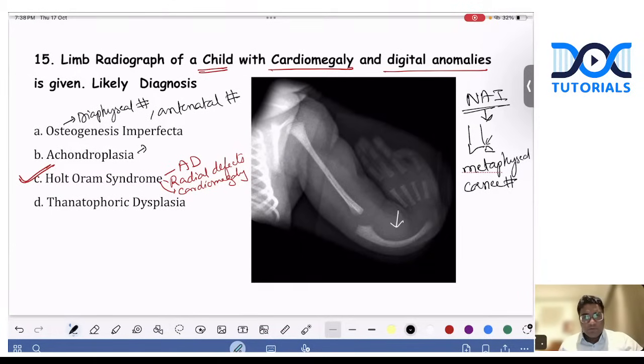Achondroplasia, you know a lot of things. You'll have the bullet-shaped vertebra, chevron sign, right? So you see the metaphyseal areas having the V-shaped lucencies. That is your chevron sign. And you also see champagne glass pelvis, horizontal acetabulum, tombstone iliac bones. Okay, the chevron sign. That is achondroplasia.